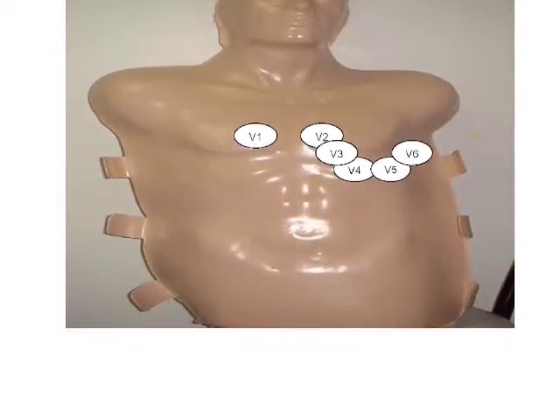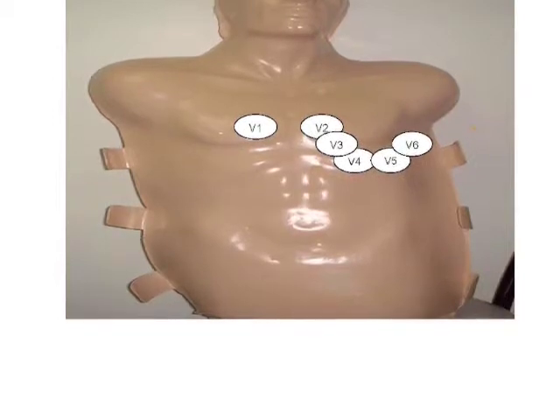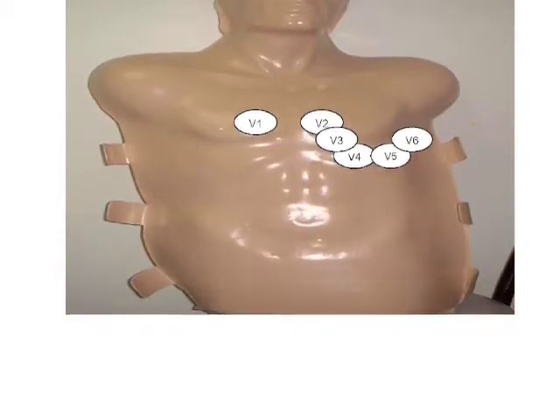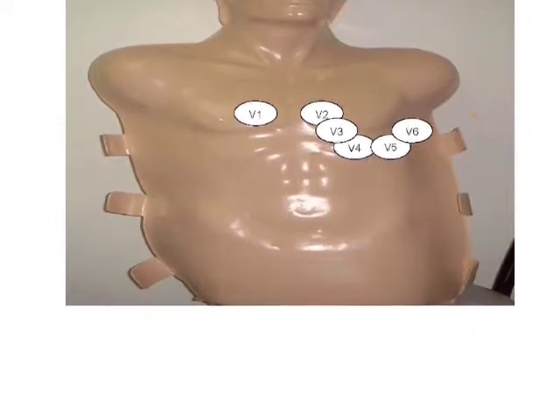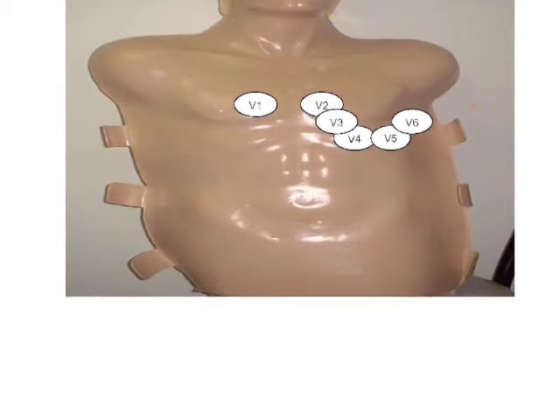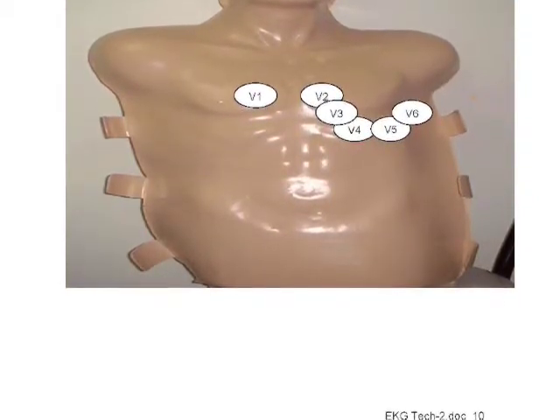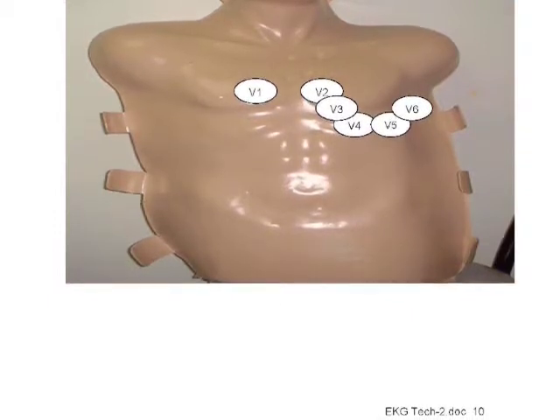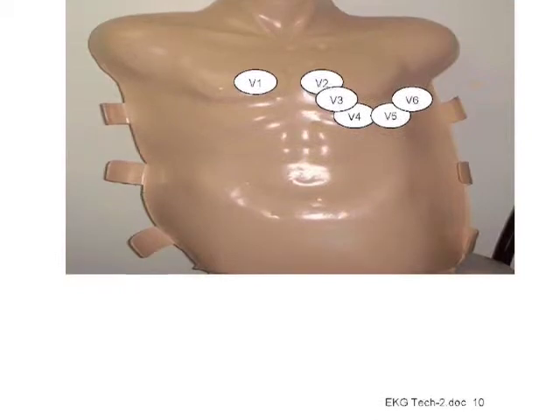Now, when you're looking at page 10, you can see how V5 slightly curves up. It's because your rib cage begins to curve up on that side of the chest. Well, on either side of the chest, your rib cage curves up. V6, horizontal to V4, so that's also in the 5th intercostal space. Mid-axillary line, once again, axillary is armpit, mid is midway.